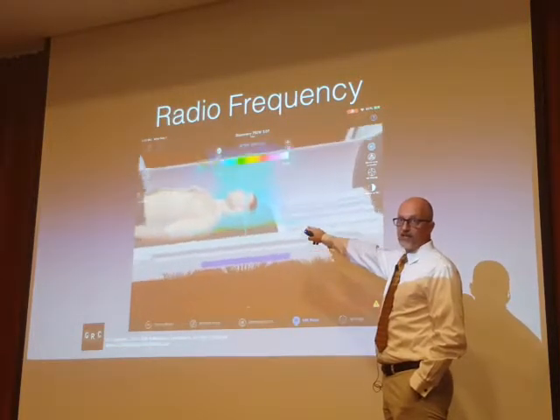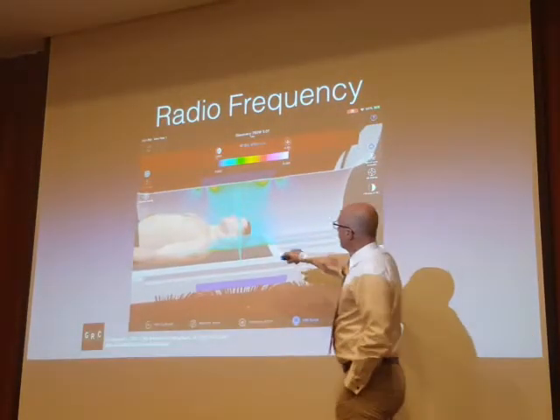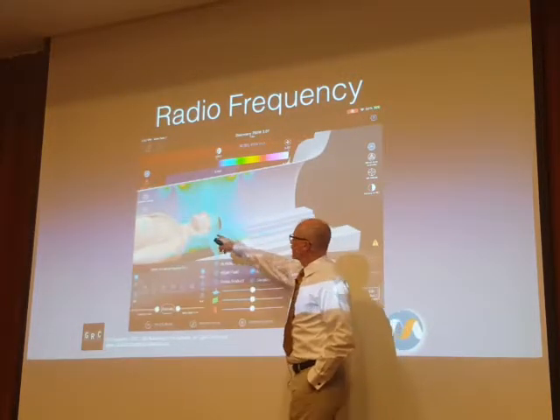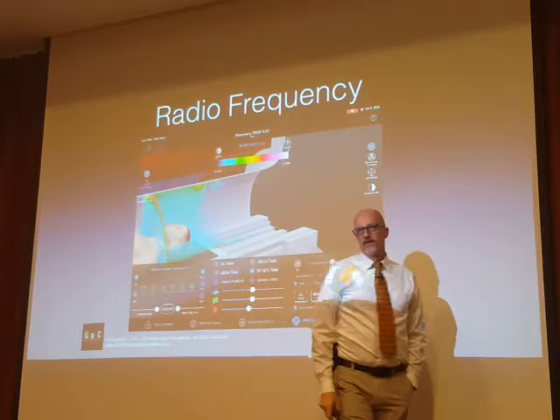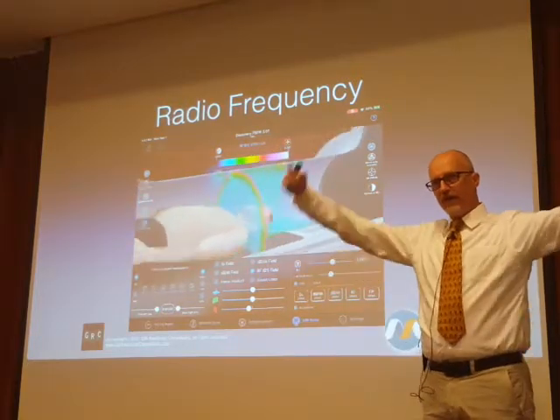Even if you're doing a head study, if you're using the body coil for transmit, remember the plot that I described that your manufacturer has to include that says radiofrequency power is greatest at isocenter? Turns out it's about 20 centimeters superior and inferior radially.